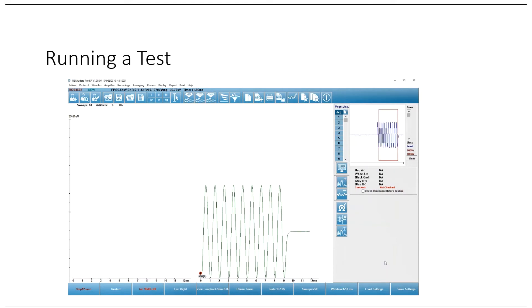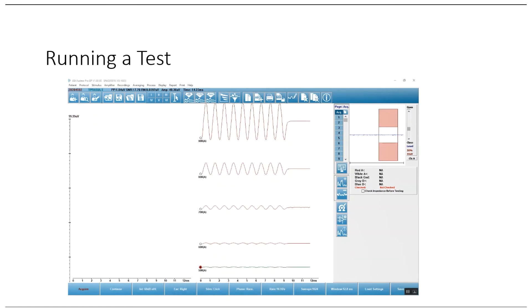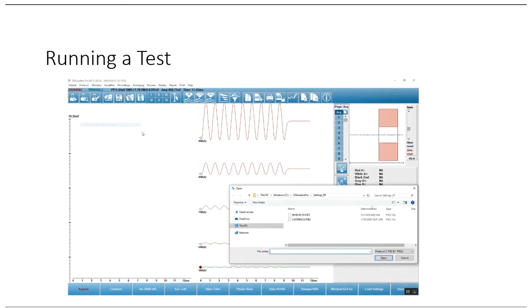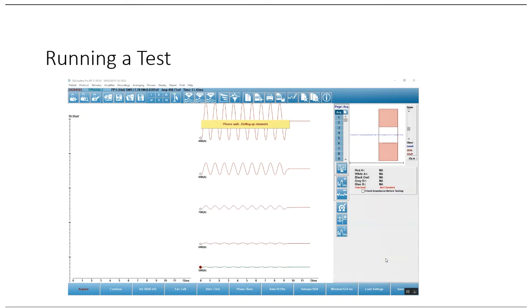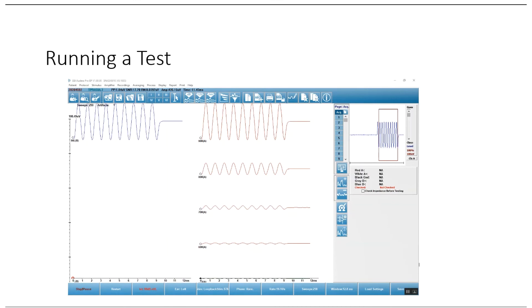Here you can see a recording has started at 90 dB in channel A — a nice smooth sine wave, which is exactly what you should see. The protocol runs from 90 to 50 dB in 10 dB steps. Then switch to the left ear, go to Protocol > Execute Automated, select Loopback, and complete the test for the other side. You should see a nice smooth sine wave starting at 90 dB, identical to the other channel.